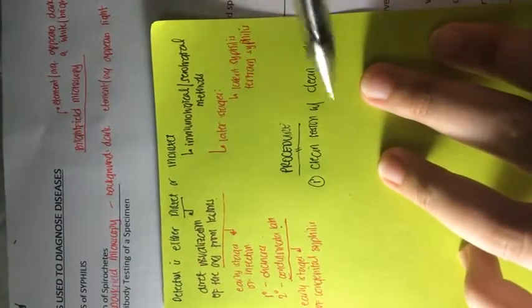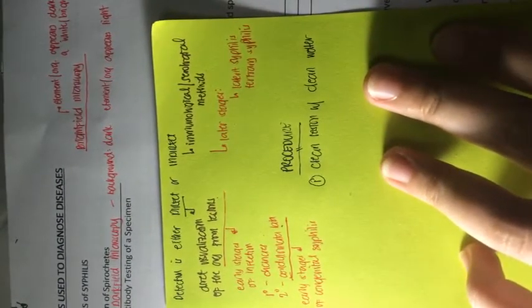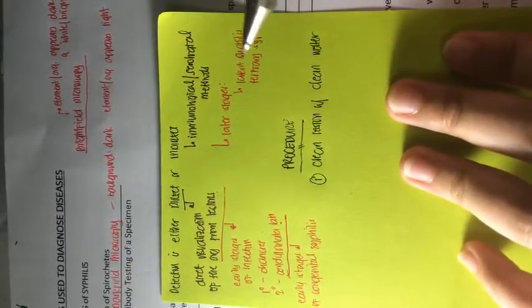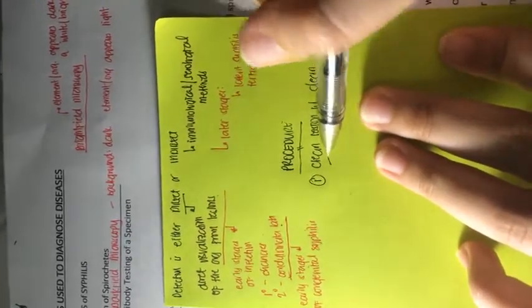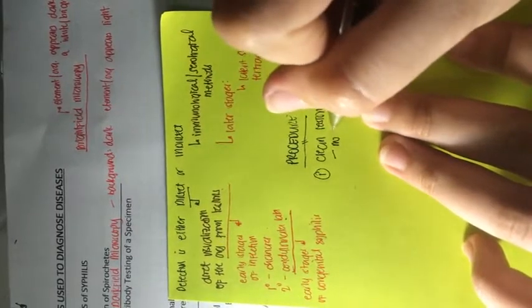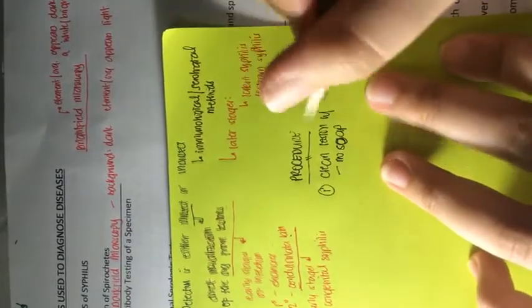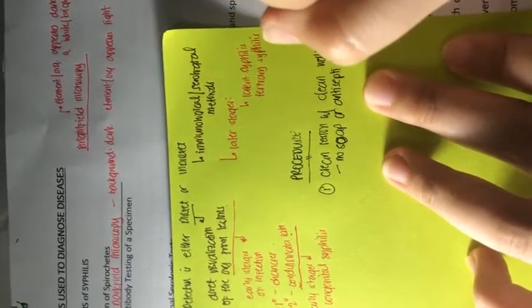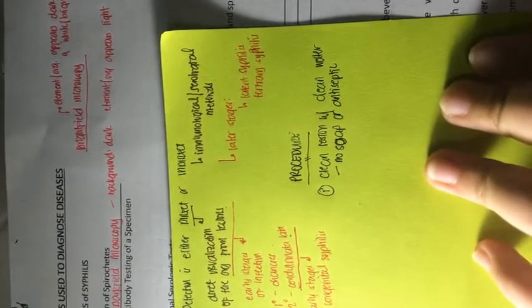So what is the purpose of cleaning the lesion with clean water? This is to eradicate the presence of the normal flora so that they will not cause any discrepancy in the detection for syphilis. So please take note that we should not use soap or antiseptic when cleaning the surface of the lesion.